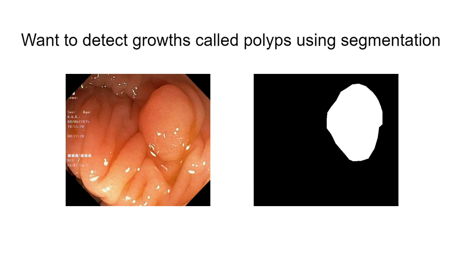In particular, they look for these growths called polyps, which as you can see here are precursors to colon cancer. So they want to remove these. But when they take these colonoscopy videos, thousands of frames are collected. So it's important to improve the automatic detection of these polyps so we have more efficient and reliable colonoscopy analysis.